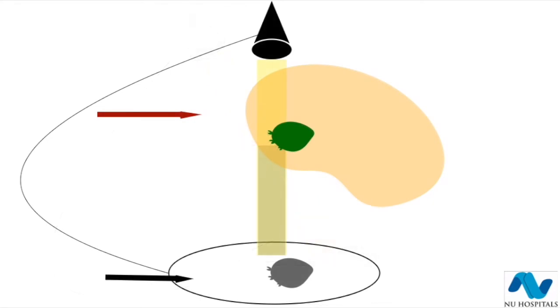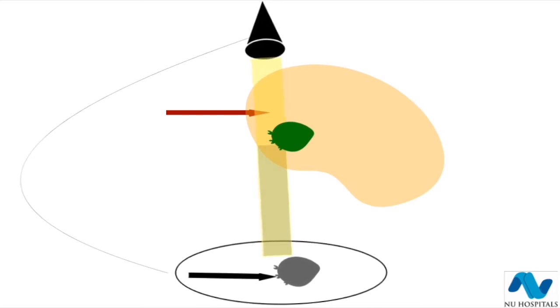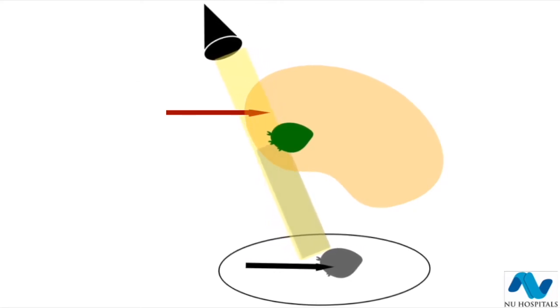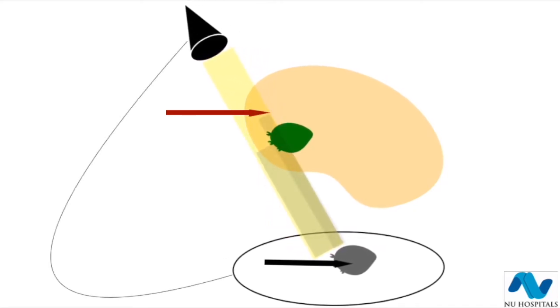Next let us look at a needle that is going superficial to the kidney. At 0 degrees the needle tip has reached the edge of the calyx. Once we turn the c-arm to 30 degrees, the shadow of the needle is falling on the body of the calyx. When we look at the fluoroscopy screen what we see is an appearance of the needle having crossed beyond the edge of the calyx.